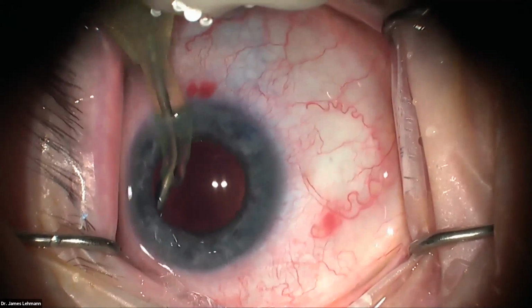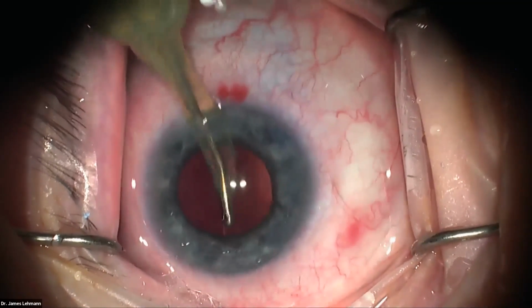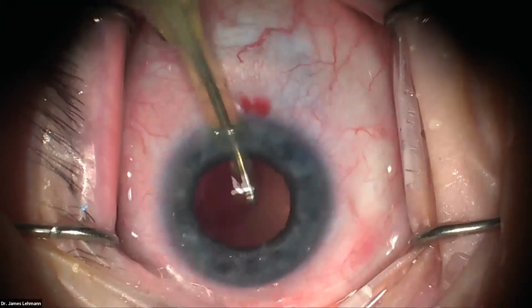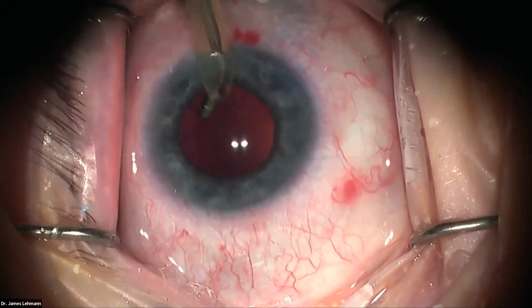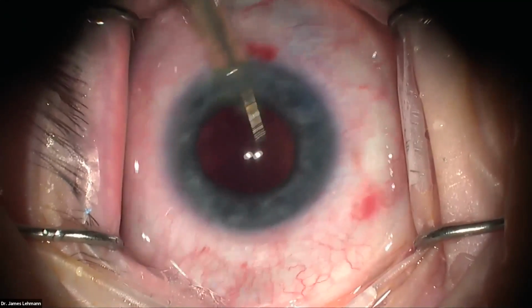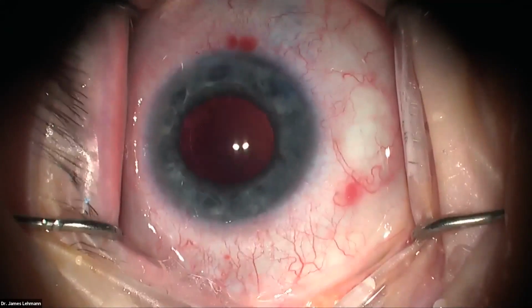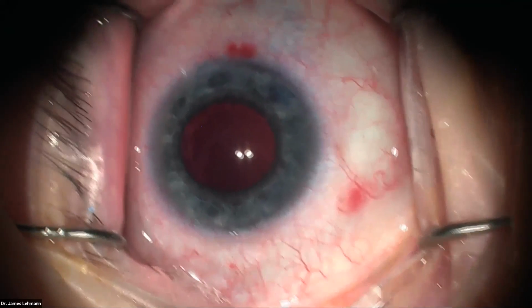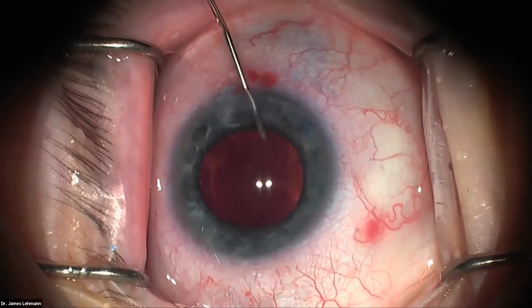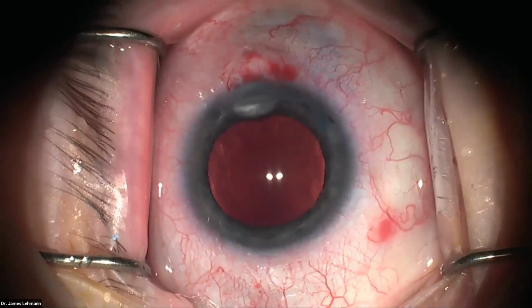I'll try to grab some over here and see how freely it wants to come. It's almost like a mature cataract in that you don't really have much cortex to go and grab. And you can see the central part is clear there. So I'm going to leave that be. And then we're going to inject the cohesive viscoelastic. And we want to see that chamber deepen a lot. And we want to see the bag deepen too. So now I got a big, deep capsule we can put this lens in.